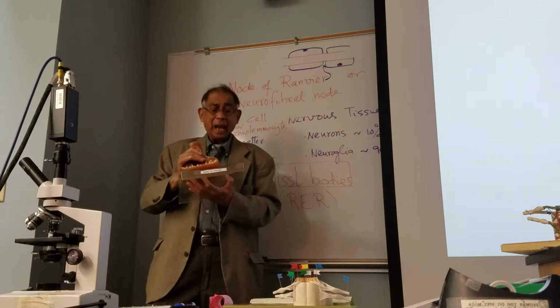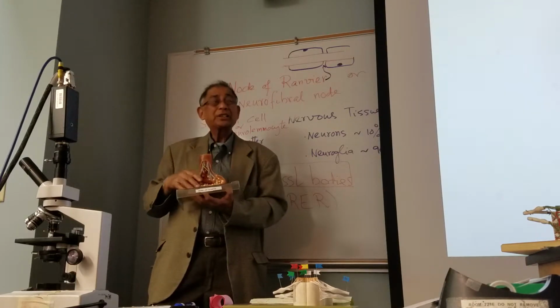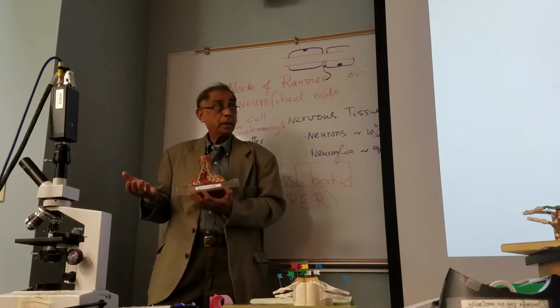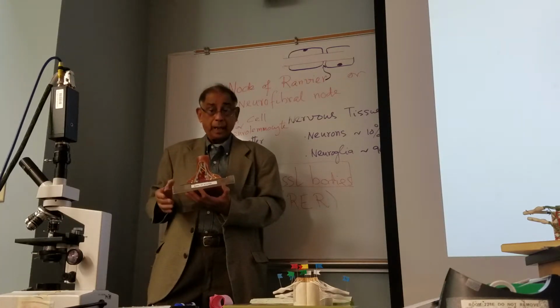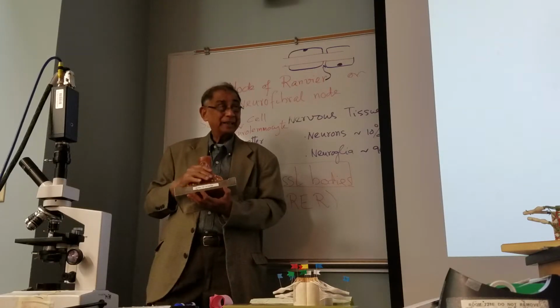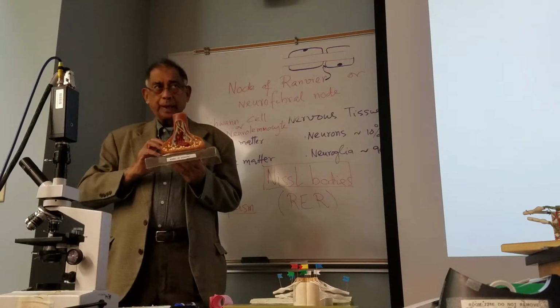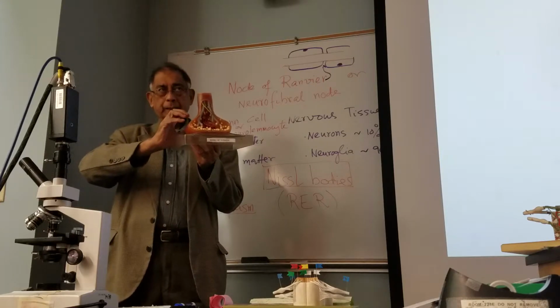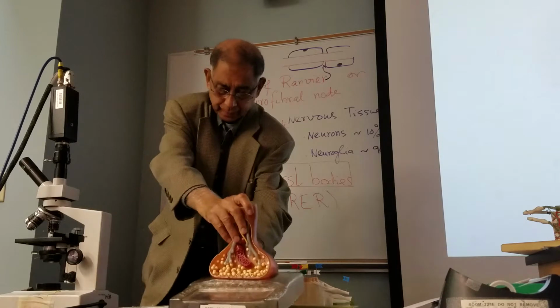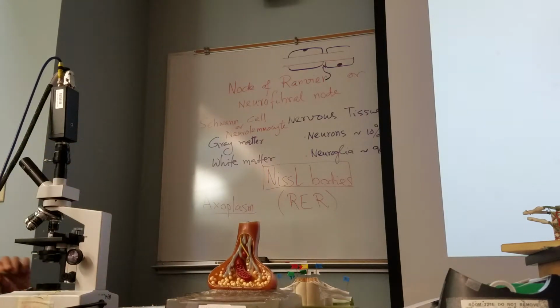I am going to show you the neuromuscular junction, which is of course a kind of synapse. That will be between muscle cells and neurons, or synaptic end bulbs. And always these nerve endings are motor nerve endings. Let's look at this.